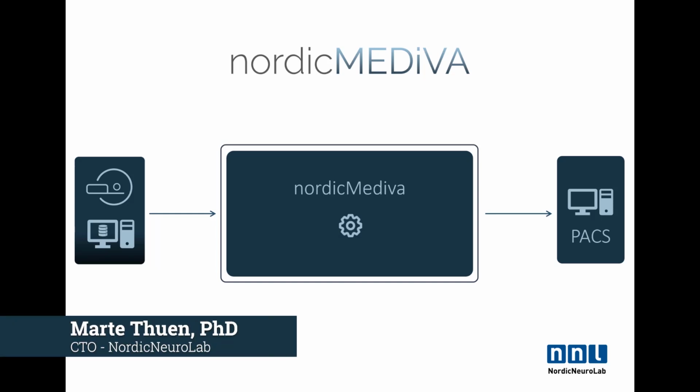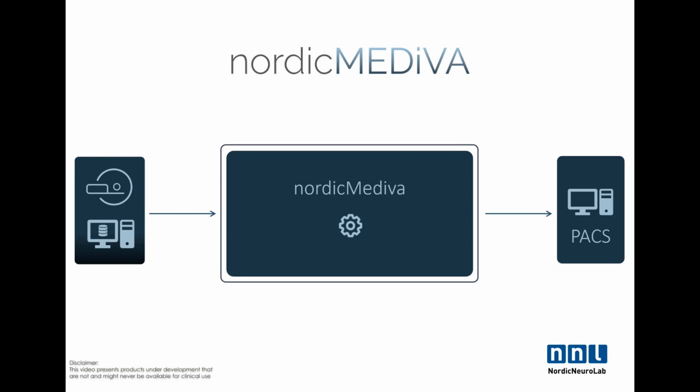So hi, I'm Marta. I work as CTO in NordicNeuroLab, and I would like to present our new software platform called NordicMediva, and currently it is available with perfusion analysis capabilities.